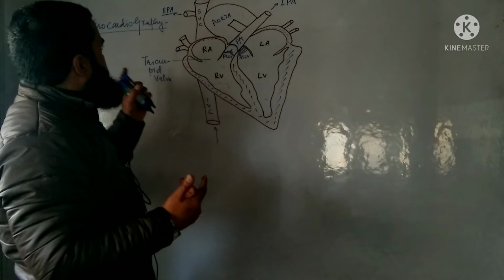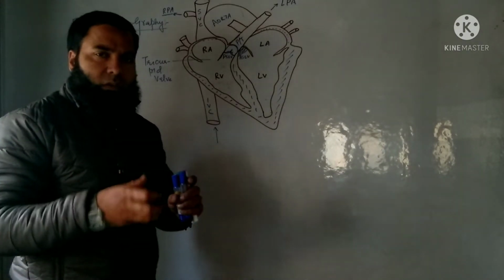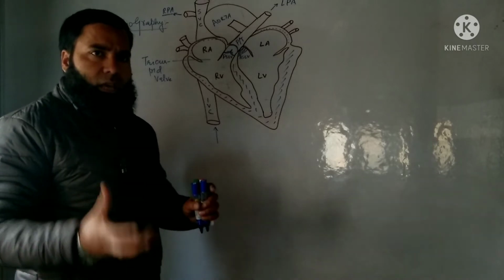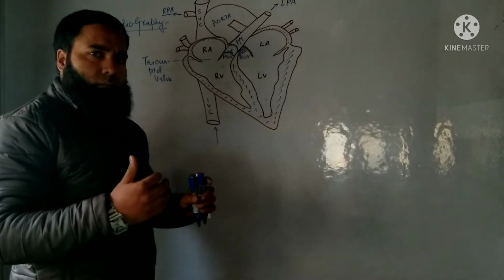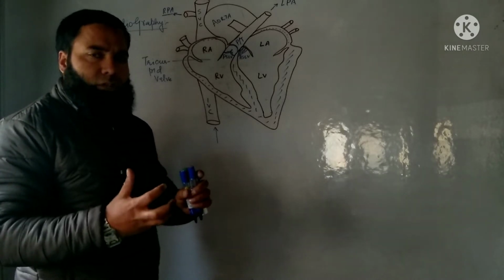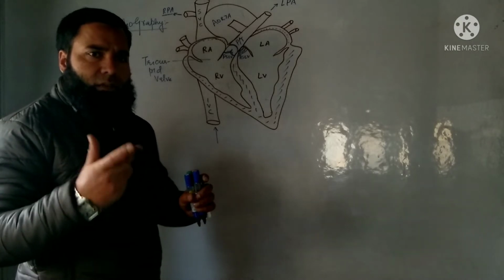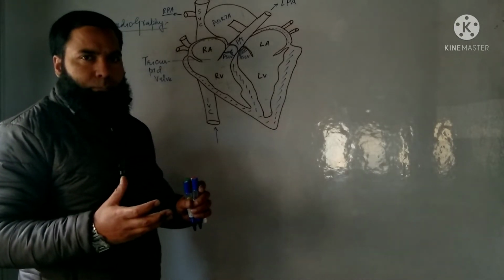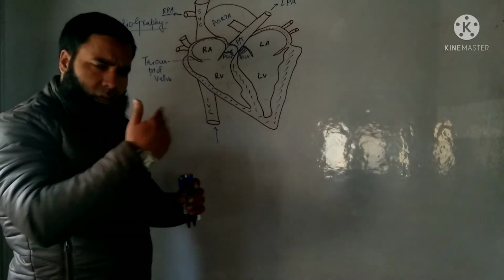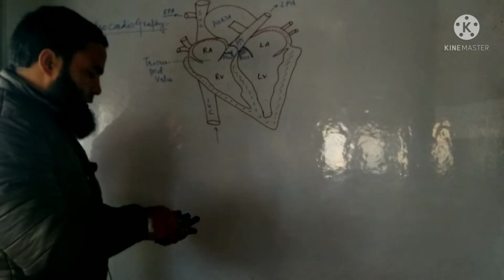And these electrical events produced by the heart can be amplified with the help of the electrocardiograph, and the recorded representation of the electrocardiography is made with the help of ECG. That's called the electrocardiogram. I will define this here on the board.